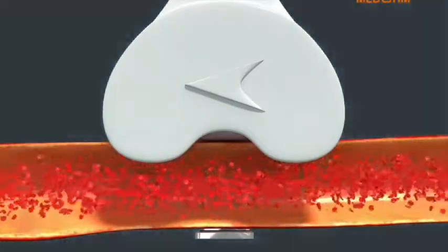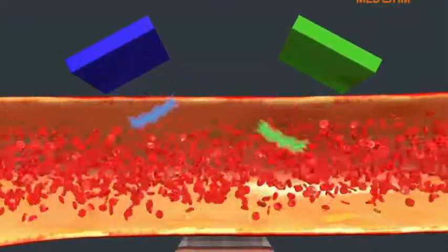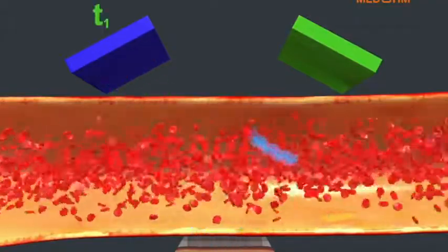A pair of ultrasound transducers fire two pulses that travel in opposite directions through the bloodstream. Both pulses travel the same distance.